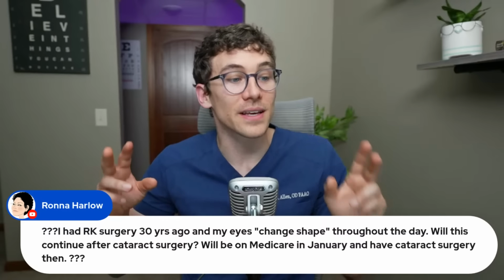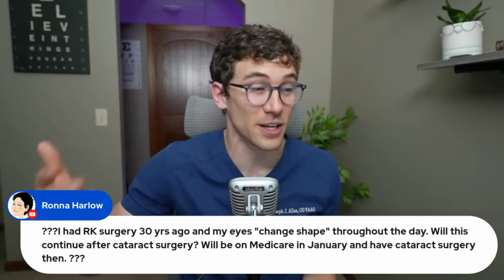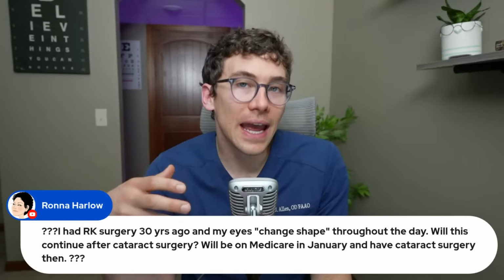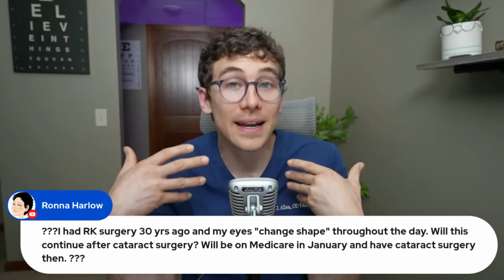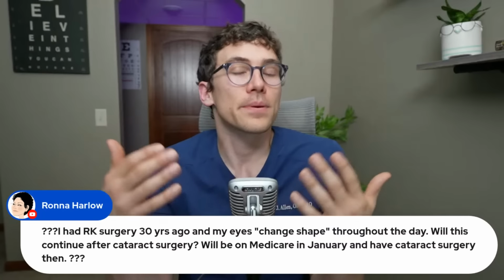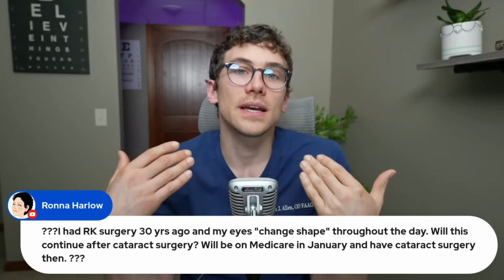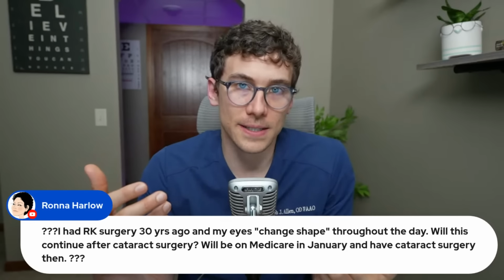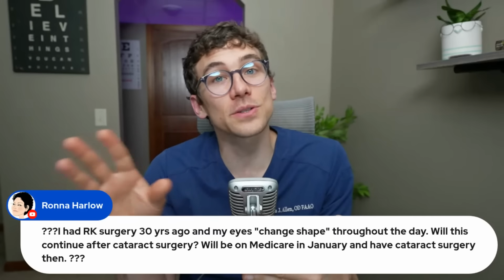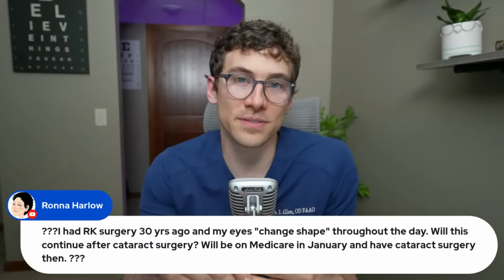like you say, your eyes change shape throughout the day, and that can be really frustrating because your vision is just constantly fluctuating. So cataract surgery can obviously change the power inside of the eye and the lens by removing the cataract, which will likely improve vision. But unfortunately, the RK incisions from that procedure can't be undone with cataract surgery. So it's likely the vision may still fluctuate afterward. And I imagine most surgeons would discourage you from considering any advanced types of lenses.